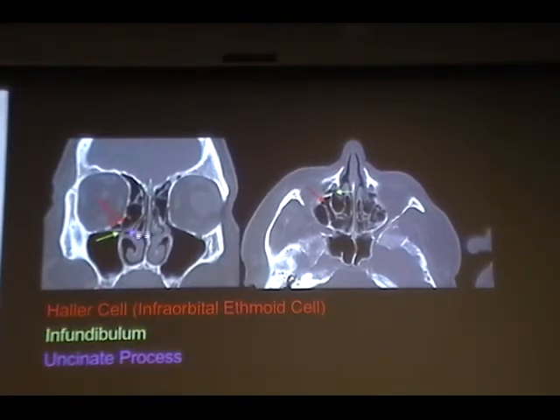Oh, this one and this one. So the air spaces? Yes, air filled. Again, when you look at those, they look like cysts, multiple cysts. Please do not get confused. So it was a variation of normal.